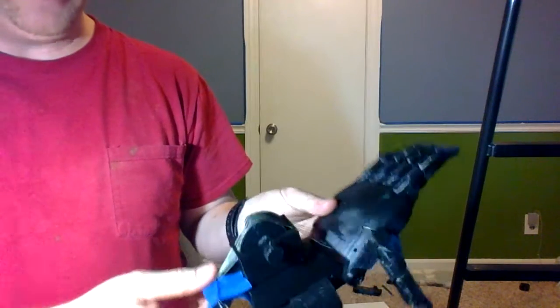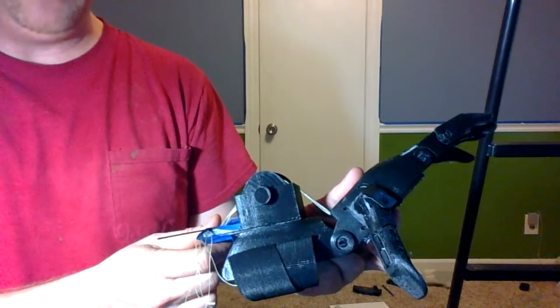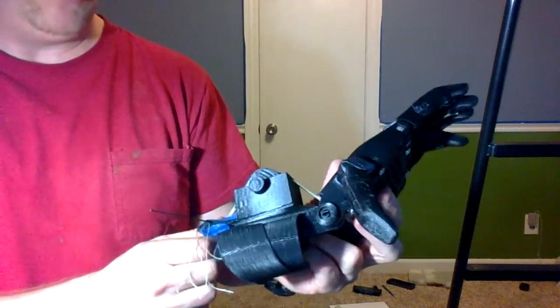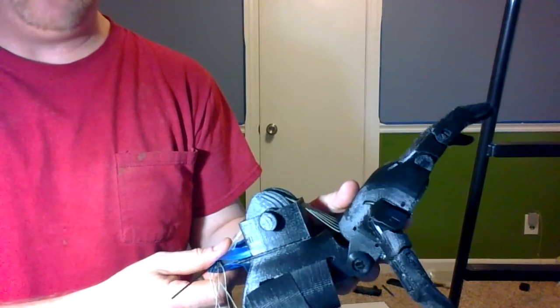So that's the idea. I'll put the files up along with this, so if anybody wants to print it and see what I've done. Obviously this is big and bulky — I'm working on a different version, but this is just to kind of prove the concept.